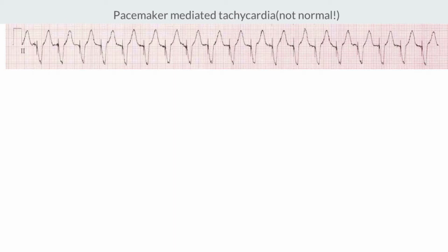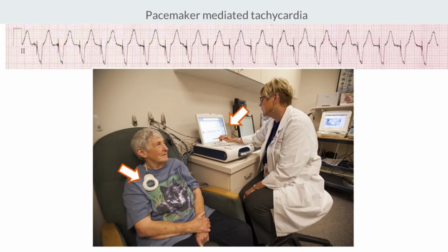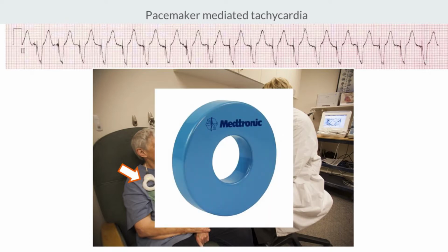Sometimes pacemakers can misbehave and cause the heart to beat too slowly, too quickly, or in an irregular rhythm. Pacemaker reps and cardiologists can wirelessly interrogate the pacemaker and make various changes to the settings, but until they arrive in the ED, something we can try is called a pacemaker magnet.